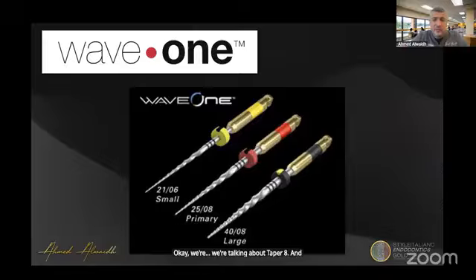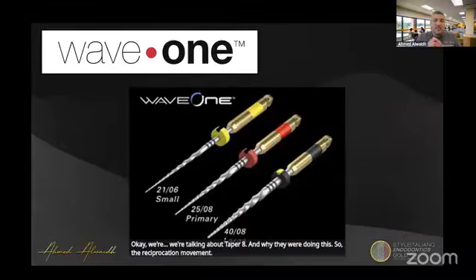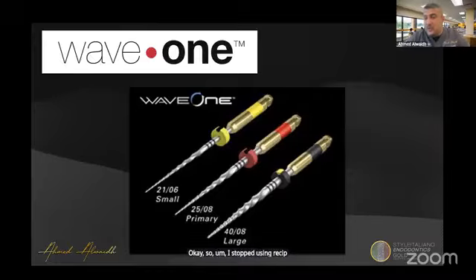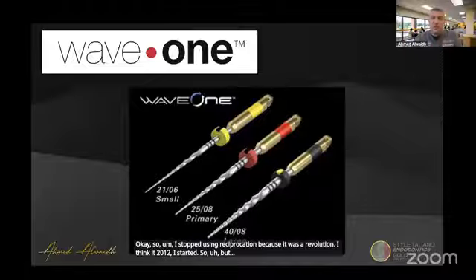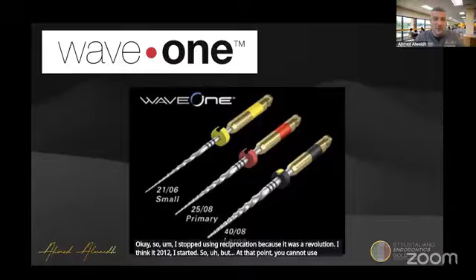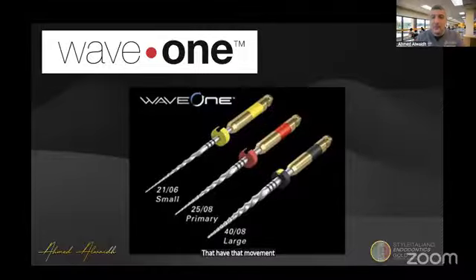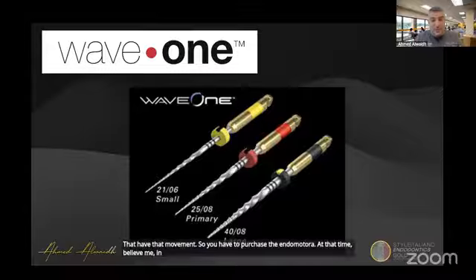And why were they doing this? Because the reciprocation movement was not enough to make the file resistant to fracture. I started using reciprocation because it was a revolution. I think in 2012 I started. But at that point you cannot use only the files, because you need an endomotor that has that movement. So you have to purchase the endomotor. At that time, believe me, in 2012, it was very expensive.